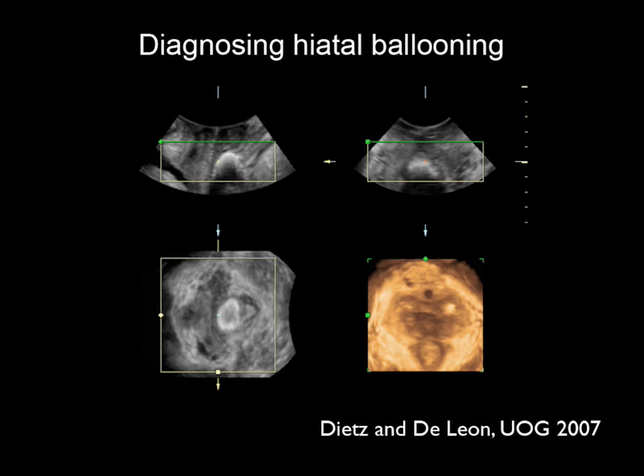And maybe just watch this down here. It's a really old clip, which I keep for nostalgic purposes, because I didn't understand what was going on when we did this clip. And watch what's happening here now. She's doing a Valsalva. It's enormous. This levator is sufficiently wide to admit the passage of a 34-week baby. It's not surprising at all that she has a prolapse. Anyone would have a prolapse with that.